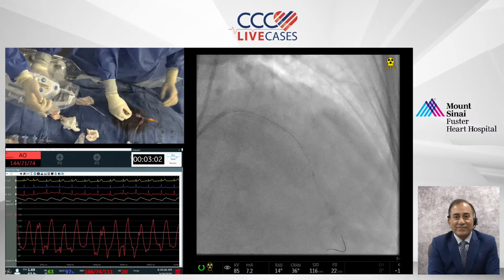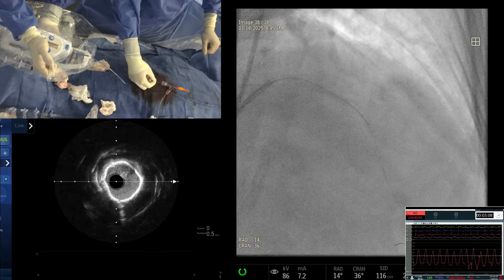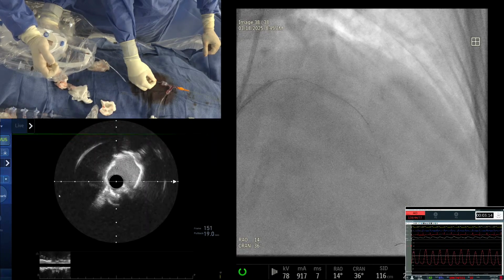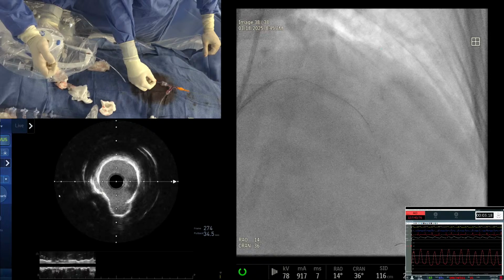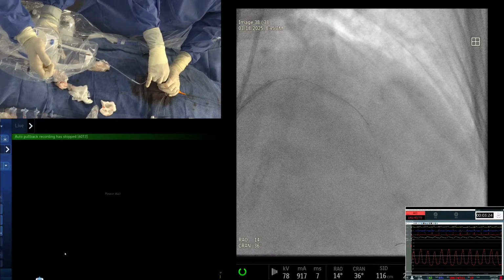Can you show the IVUS on the screen? Okay, good. So it's a 360 calcium arc. I'll start pullback. Still there. Yeah, I see some small fractures. Definitely different from the initial pullback. Now come to left main. Nodule still, of course, there. Okay, the tightest area, right?